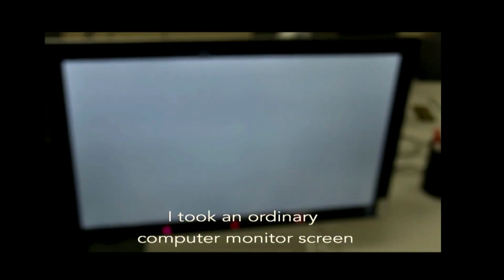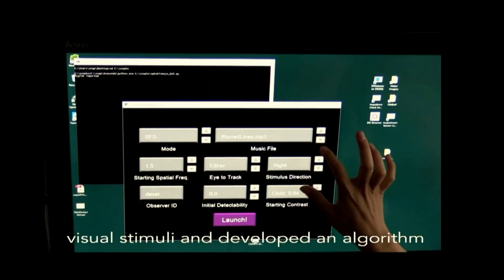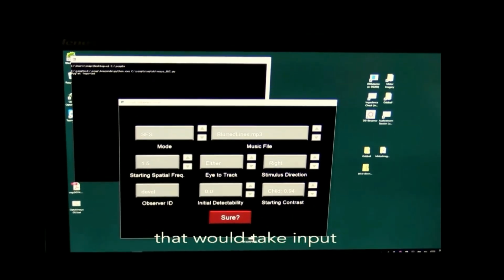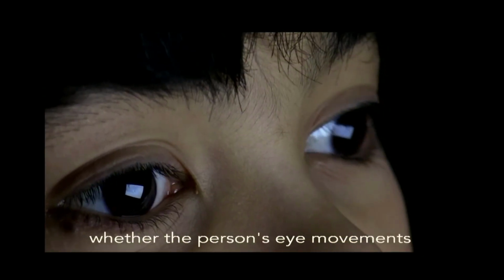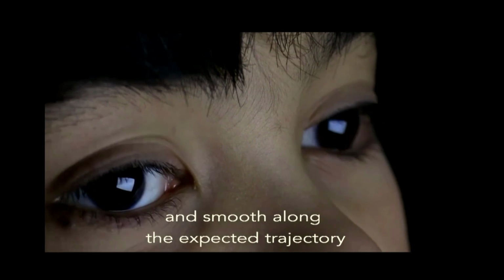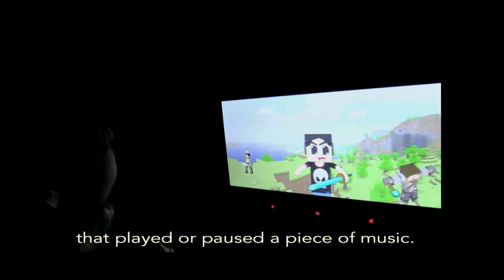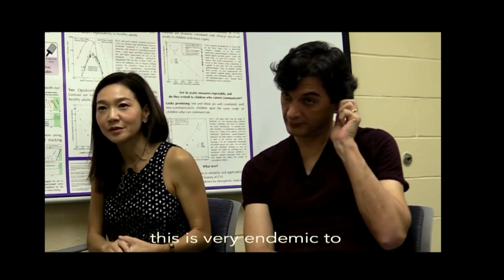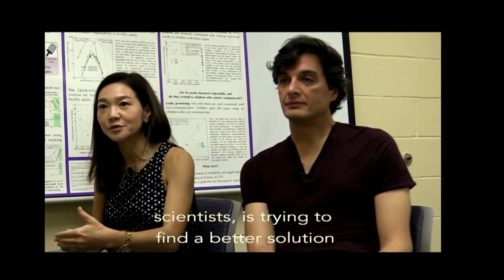I took an ordinary computer monitor screen, as wide as we could find, and I used some of the software toolboxes that are out there for presenting very carefully controlled visual stimuli, and developed an algorithm that would take input from an eye tracking device and determine in real time whether the person's eye movements were smooth or not, and smoothed along the expected trajectory, and connected that to a system that played or paused a piece of music. What these guys do, and I think this is very endemic to people who do research, scientists, is trying to find a better solution than what you have today.